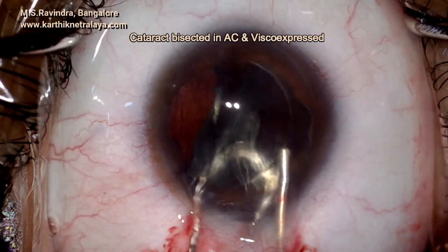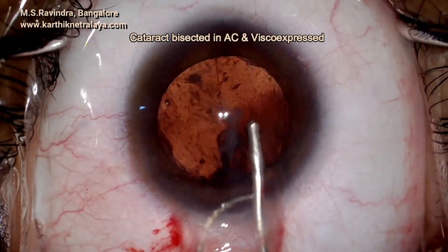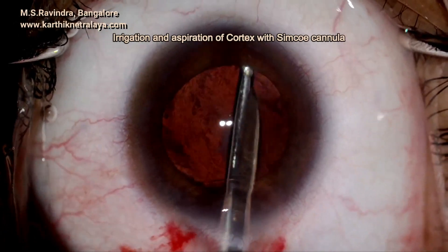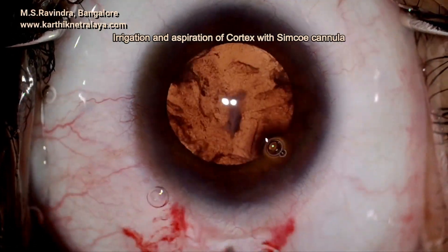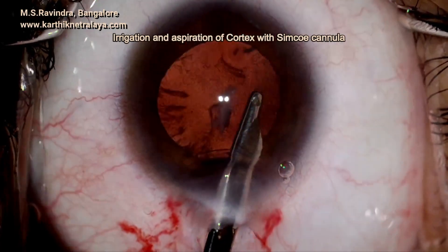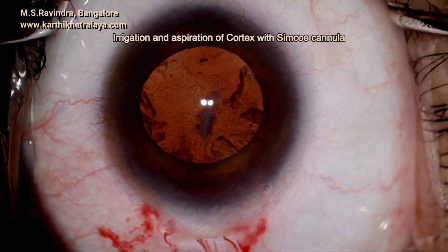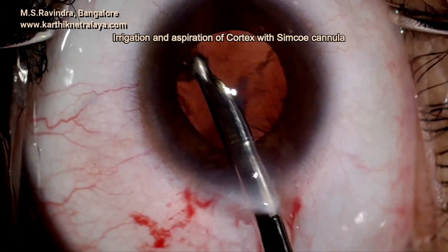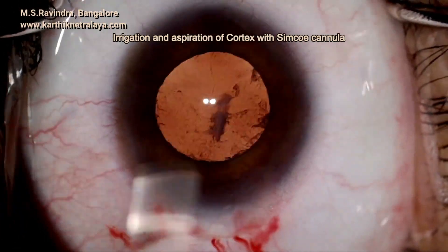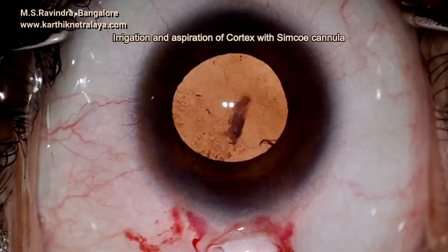The cortex is easily aspirated with a Simco cannula with active infusion and aspiration. The posterior capsular opacity was attempted to be polished or excised or removed, but it is very stubborn and attached to the posterior capsule. The subincisional cortex is aspirated with J-shaped Simco cannulas.